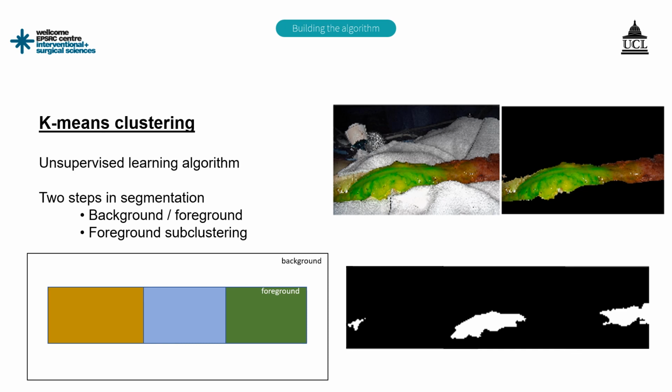So in this slide, we can see on the top left of the colonic image, there is a perfused part of bowel shown with ICG, and what the algorithm needs to do is understand what is bowel, what is perfused bowel, what is ischemic bowel, and then also what is the background, what is the swabs.